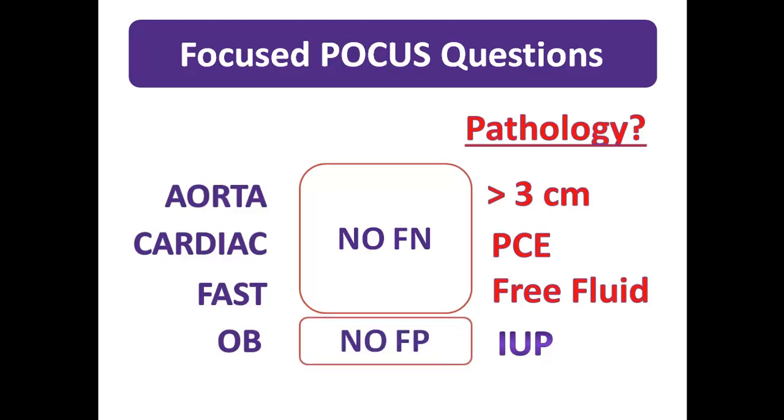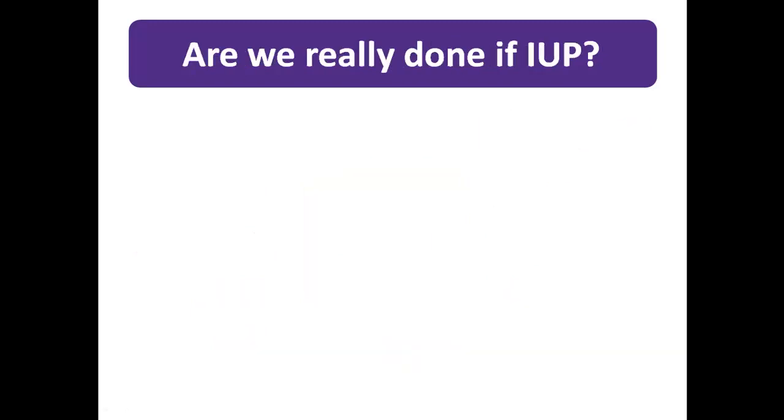To do so would be extremely dangerous, as one would then dismiss the life-threatening ectopic pregnancy, potentially putting the patient at peril. For this reason, the obstetric scan in first trimester is arguably the most dangerous study you will perform. You must be confident you are seeing an intrauterine pregnancy and be very careful not to overcall your findings on screen. To reiterate, in the vast majority of patients, once you have confidently declared an IUP, then ectopic pregnancy is effectively excluded as a cause for their presenting symptoms.